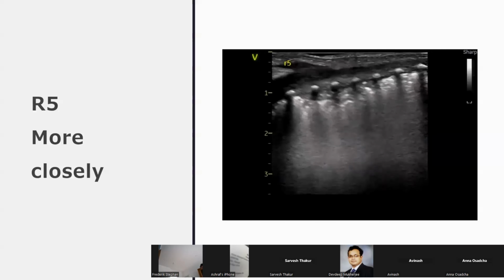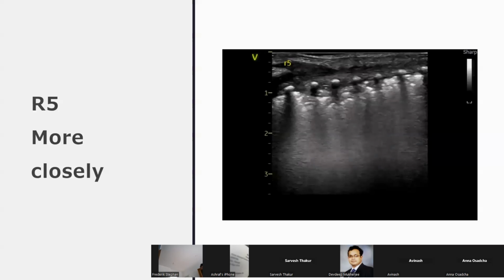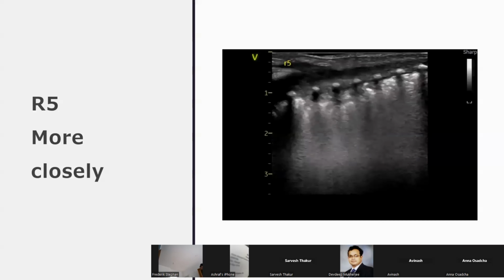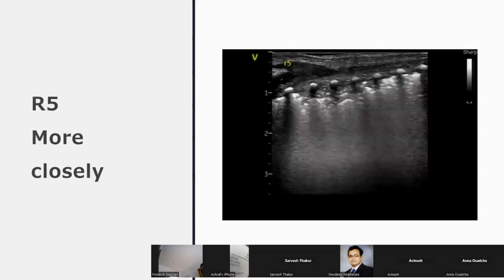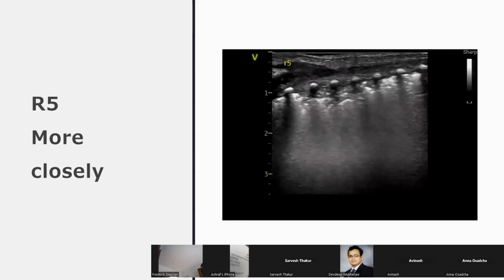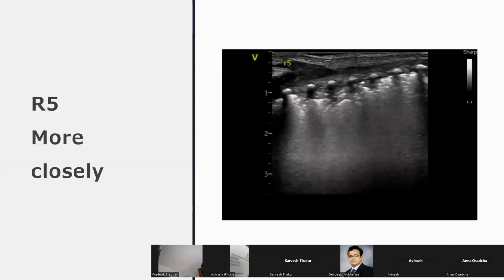There are 3 options when we click lung ultrasound: penetration, resolution, and general. It won't be under penetration or resolution. It'll probably be under general. But for all of you using a GE, I will show you how to do it on the GE.